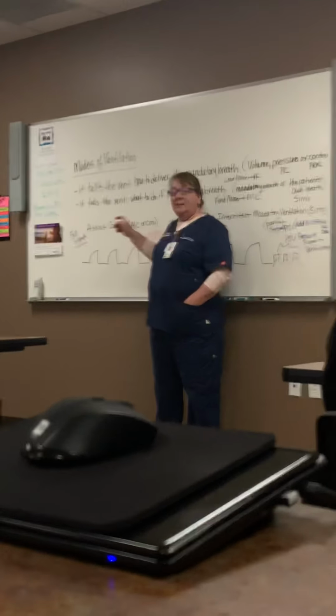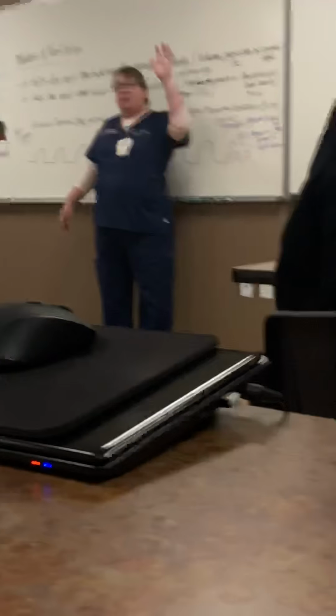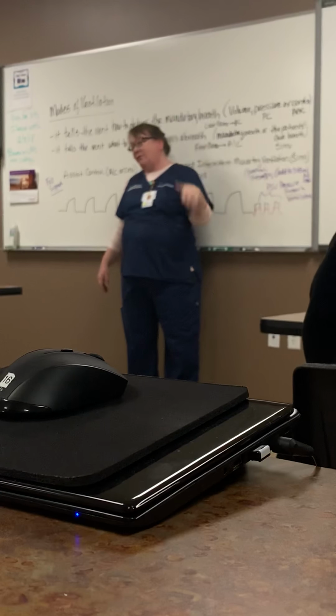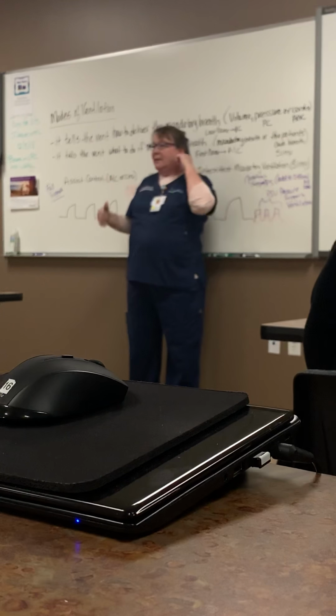The old method of going AC, then to SIMV, then we would slowly go down on the rate. They're on 12, now they're on 10, now they're on 8, now they're on 6, now they're on 4, and now we'll put them on pressure support and see how they do, and then we'll extubate them. That takes like an entire day.